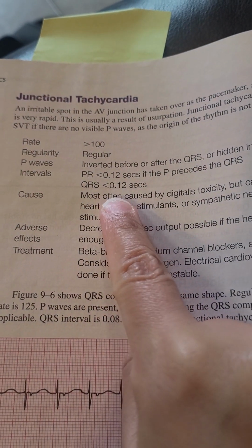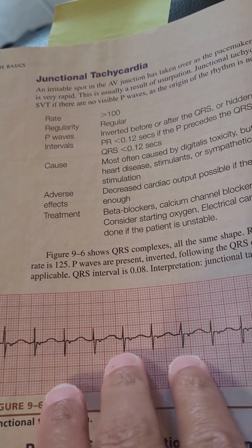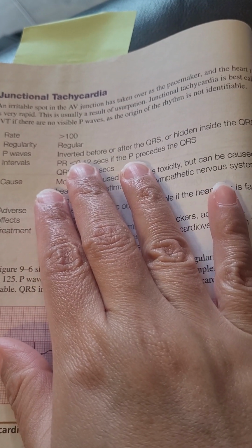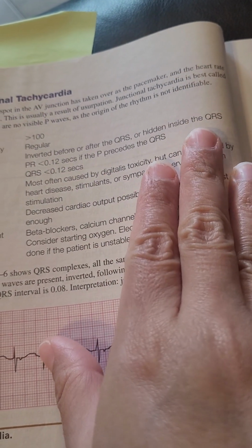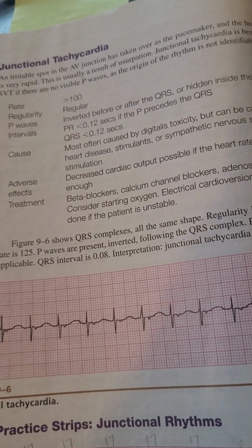Yeah, 12. So it's got to be greater than 100. It should still be regular looking. Again, the P waves have to be inverted before or after the QRS, or hidden inside the QRS, or, like I said, no P wave.